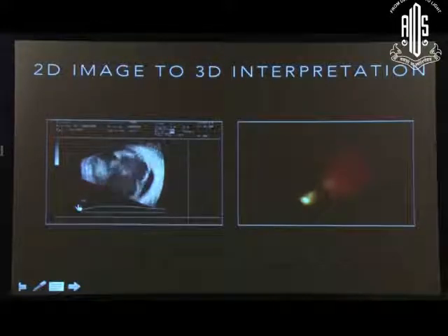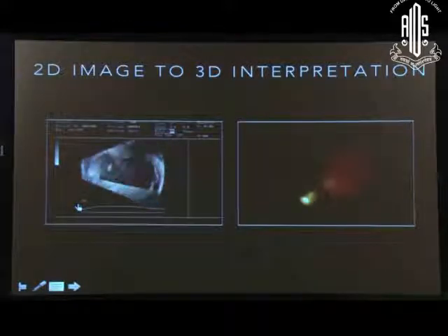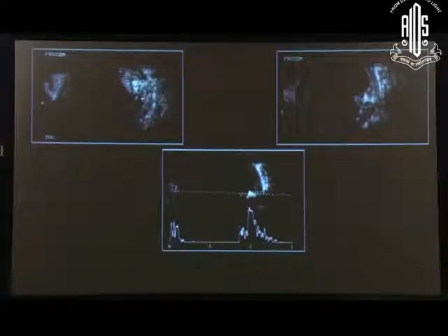Look at this undulating membrane that's attached to the disc. It almost looks like a serpent doing a dance if you look at this here. This is typical of a giant retinal tear. Okay? And this patient underwent surgery. And you see the blood being cleared. And this is what the picture was, indicating that we were right in our diagnosis. So any snake-like movements of membranes, high reflective, attached to the disc, always think of a giant retinal tear.